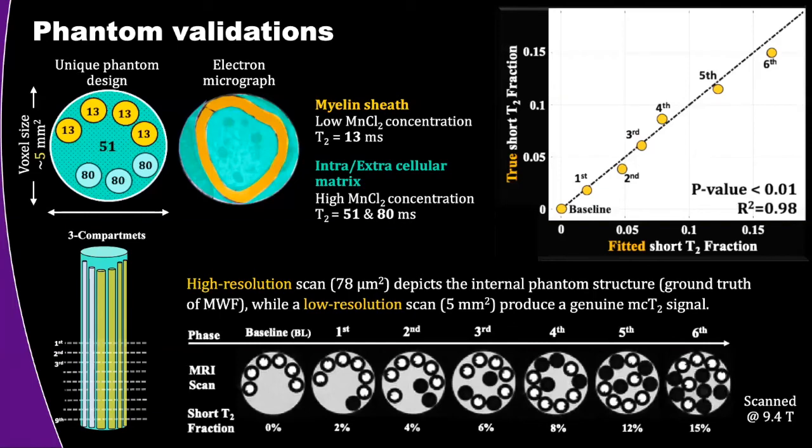You were asking about short T2 components, and generally, when you use an echo modulation curve, that echo train length with the echo time of 10 milliseconds, 20, 30, up to 150, you won't be able to see short T2 components. We limit all of this analysis to half of the first TE. So anything below 5 milliseconds, we're saying this is invisible. We are not able to see it. We're not even going to try and fit it.